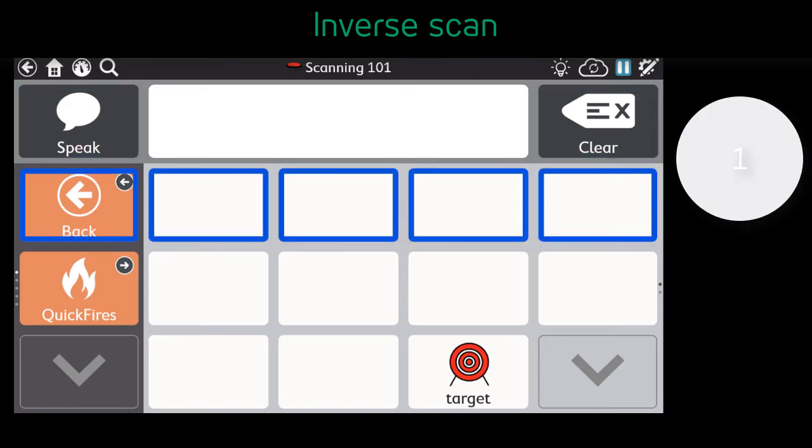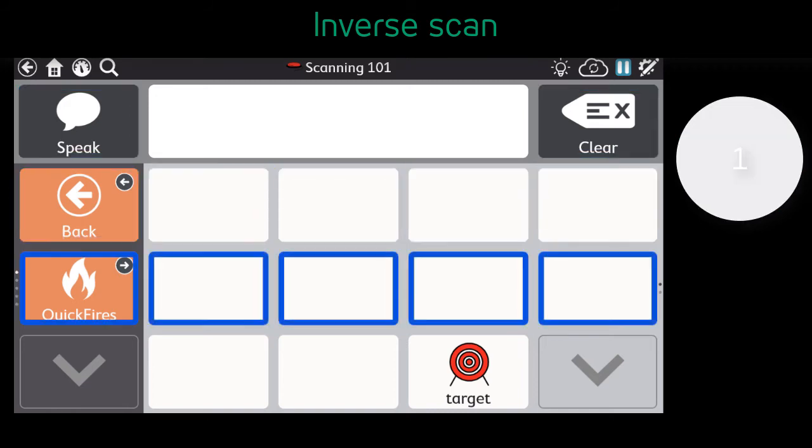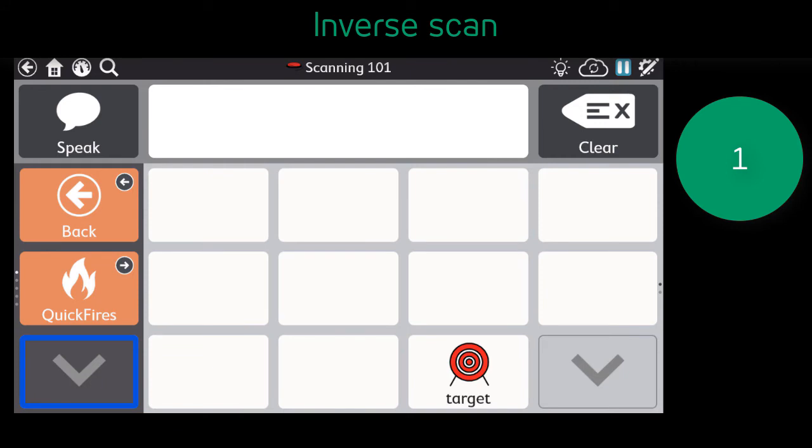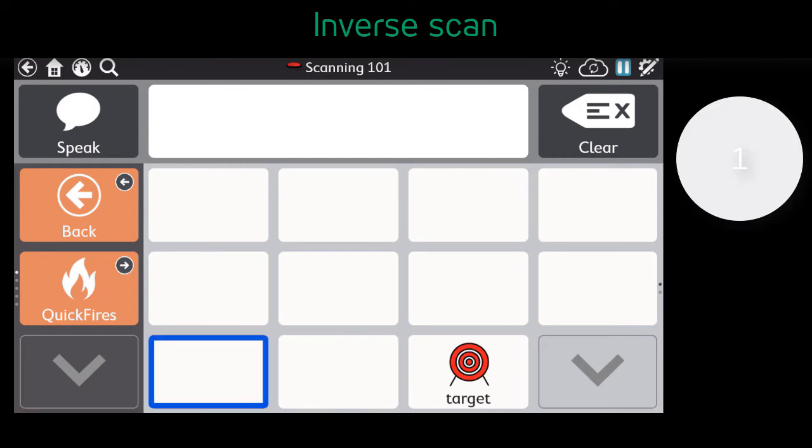Notice how the user presses and holds the switch to advance the scan, and then releases to make that selection.